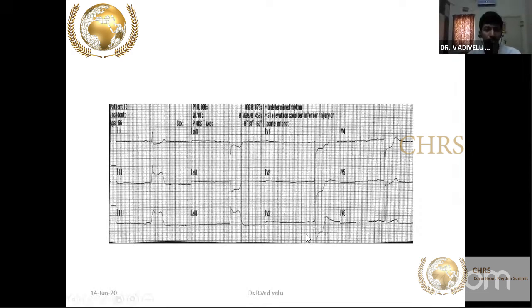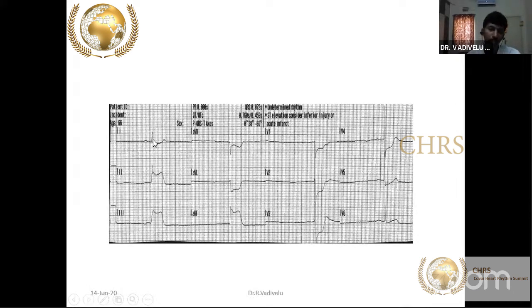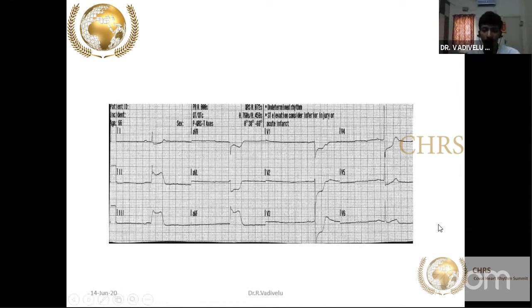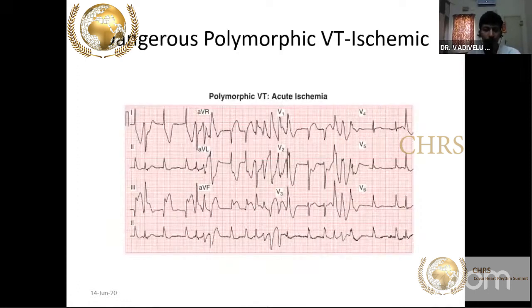In inferior wall MI: ST segment elevation in II, III, AVF. If AVL ST segment depression is more than lead I ST segment depression, it implies RCA occlusion. ST segment depression in V1 means acute inferior plus posterior wall MI. When there is complete heart block, there is no clear PQRS relationship and diffuse bradycardia — P and QRS are not related to each other.